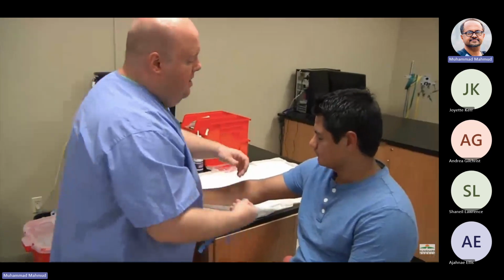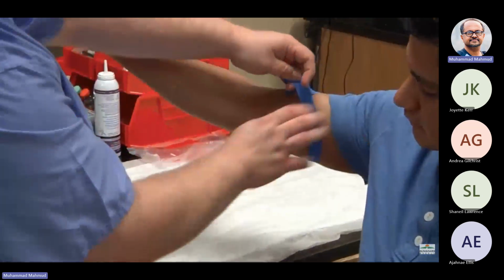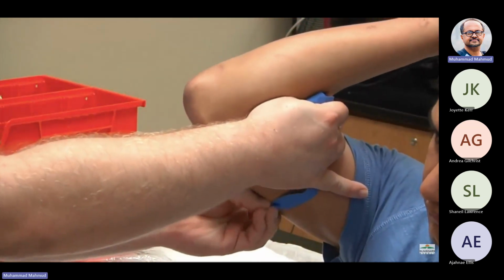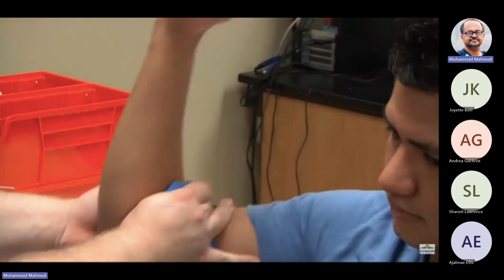Going to place it around the patient's arm. You want to keep it flat in the back. Raise your arm. If you notice in the back, it's still smooth and flush. We try not to let the tourniquet roll, as that will cause our patient a little bit of extra pain.